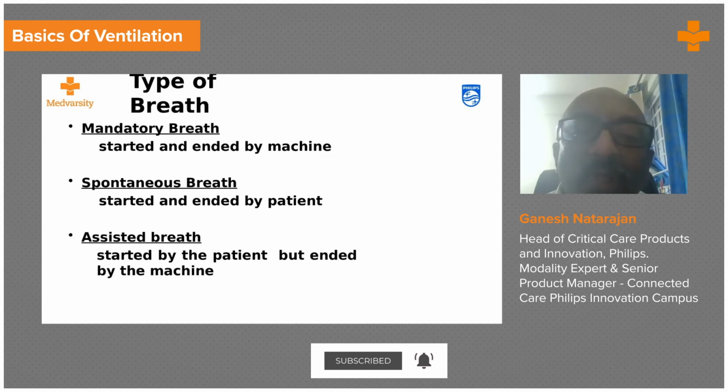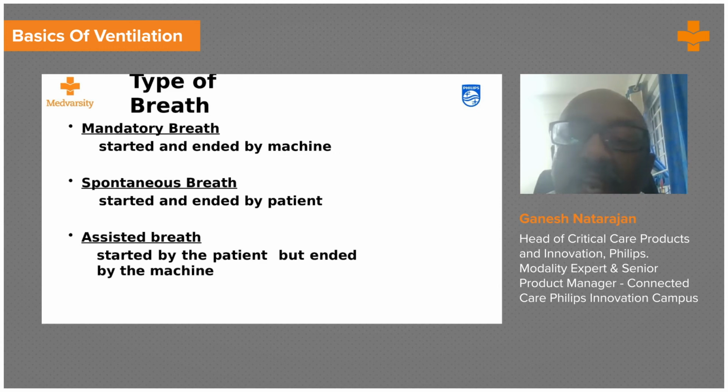Now, in a spontaneous breath, the breath is started by the patient, the breath is ended by the patient, and also the amount of volume that the patient draws in or the pressure that the patient displaces is decided by the patient itself.